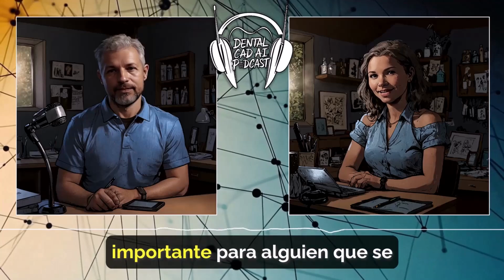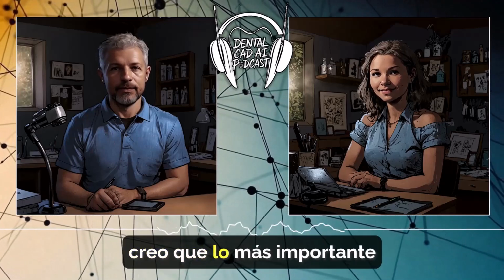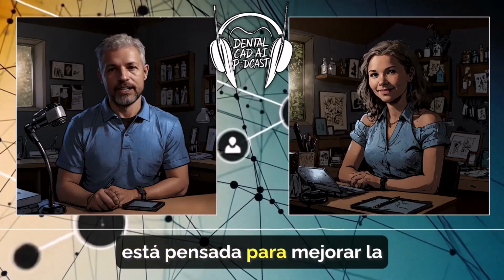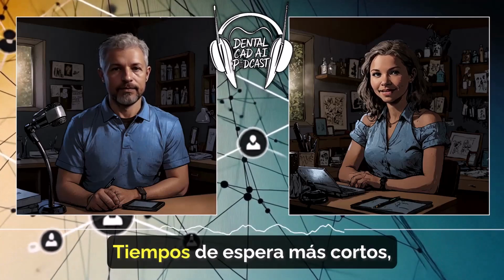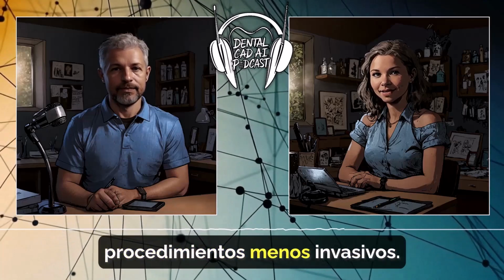Okay, but let's bring it back to the patient experience for a second. What do you think is the most significant takeaway for someone sitting in that dentist chair? Honestly, I think the biggest takeaway is that this technology, DentalCAD 3.2 Elefsina, is all about enhancing the patient experience and improving the quality of care. So shorter wait times, more personalized treatment, less invasive procedures.